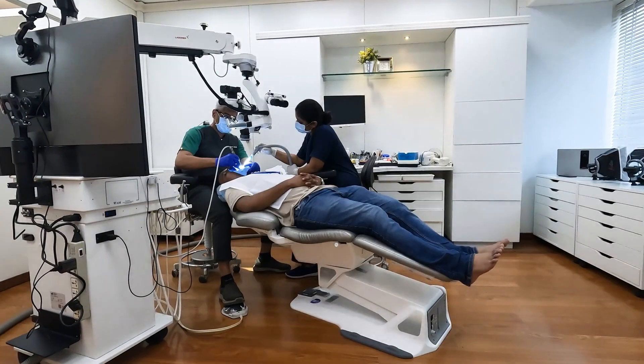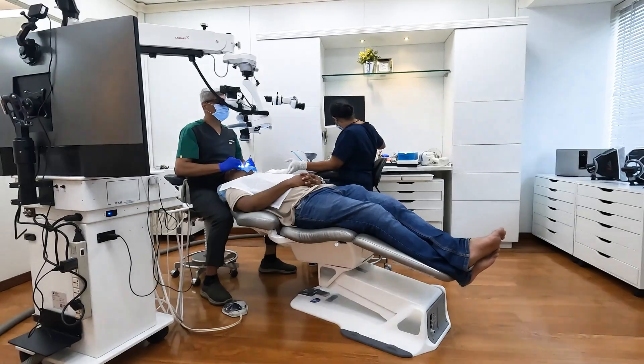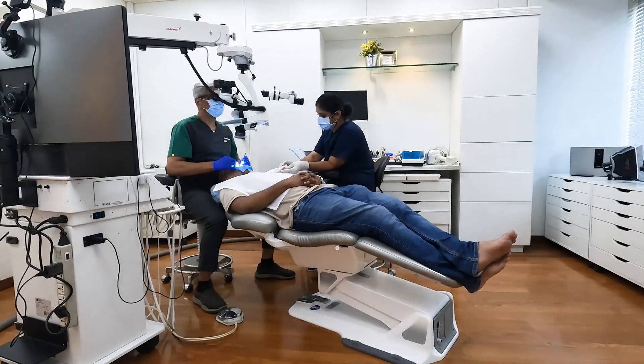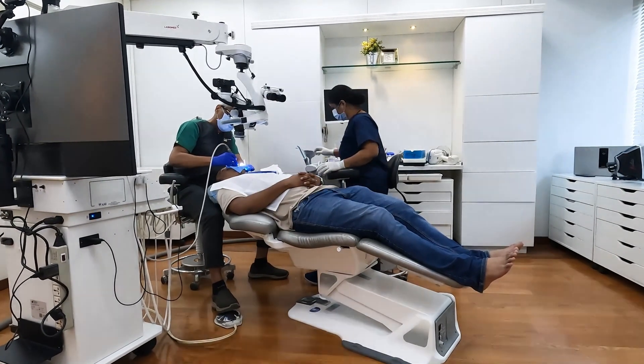In our private practice and with most students who got used to the microscope, we still keep a low-powered loop — usually 2.5x to 3.5x — and go back to it when performing procedures where we need to take into consideration the surrounding areas, such as complex surgery. Other than that, you can do virtually everything else through the surgical microscope. About 95% of all your general dentistry work — you'll reach a stage after a few weeks where you don't need the loop. You switch to the low-powered loop only in certain procedures requiring a wider field of view.